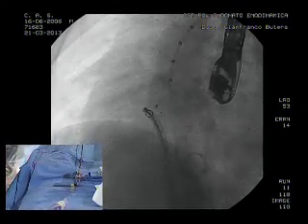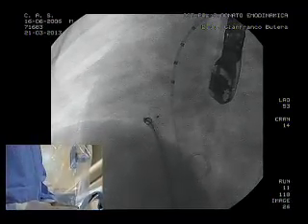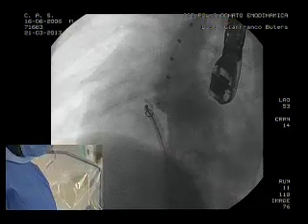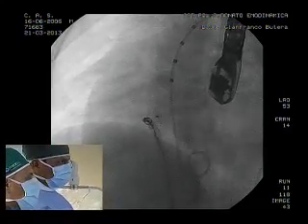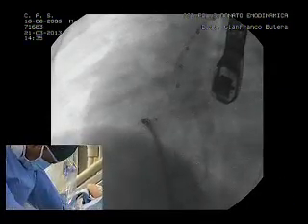Yeah. And to be honest with you, Ziad, you realize that the tip, the left disc of your device is far away from the AV node. So this device was actually great, apart from when deployed in the septal defect, sometimes we had AV block. That's right. So we're going to go ahead and release the device. So counterclockwise rotation.